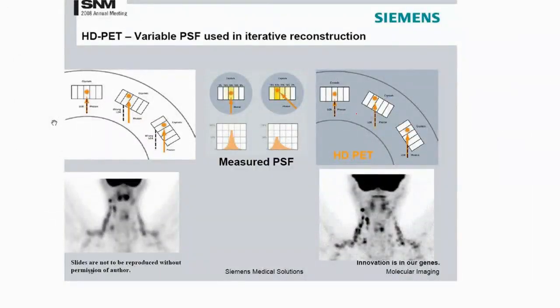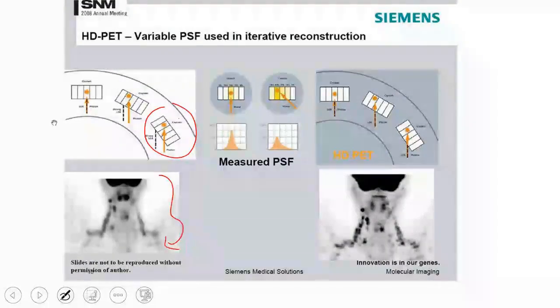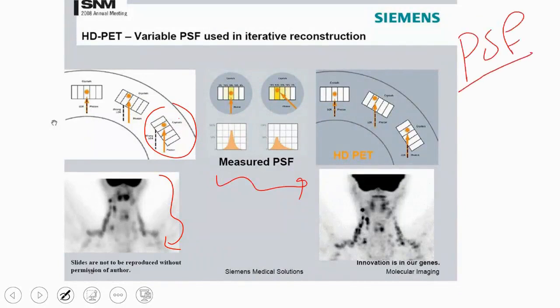This is the area we are talking about. The concept of gamma photon detection involves many detectors and performs detection in a different location than its original position. Your image is specifically focused on the peripheral area. Of course, there are some algorithms called point spread function, which are available in Siemens and Philips. This improves the detection and enhances the resolution of the image.